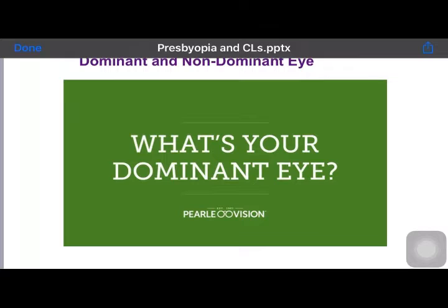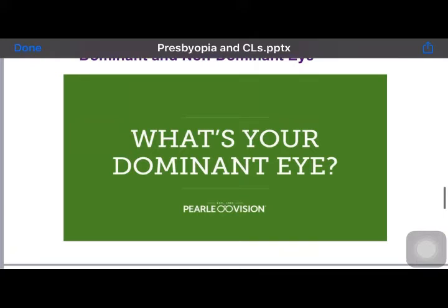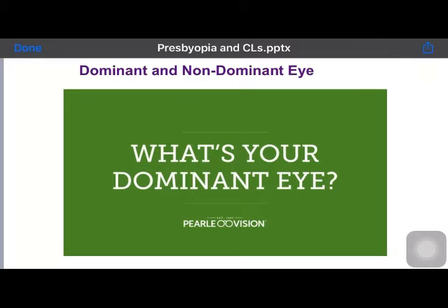So DDD means dikha, to dominant, wo dur ka troubleshooting ke liye use hoga. Nahi dikha, to non-dominant, wo nazdik ka troubleshooting ke liye use hoga. So D, dikha, D, wo dominant eye hai, and D, wo distance ka troubleshooting ke liye use hoga. N, nahi dikha, wo N, non-dominant hai, and N, wo nazdik ka troubleshooting ke liye use hoga.